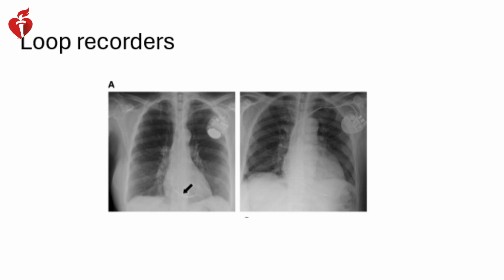And then finally, loop recorders are more and more seen here, and we've provided examples of each of the different manufacturers since they have slightly different form factors.